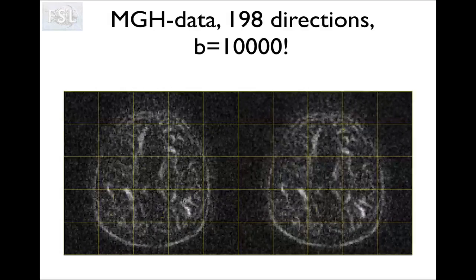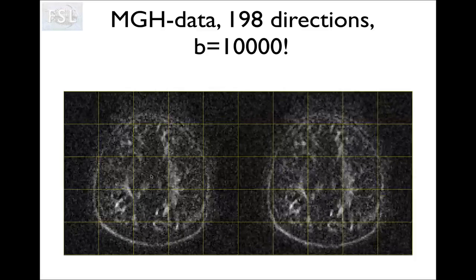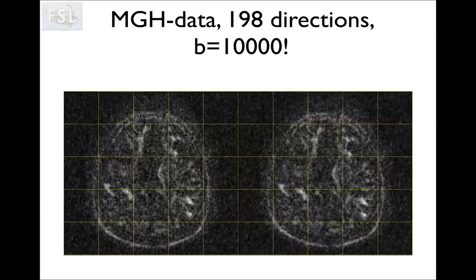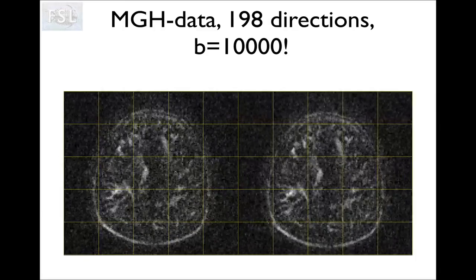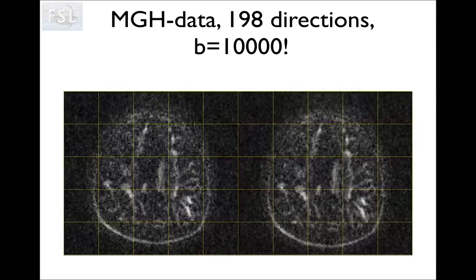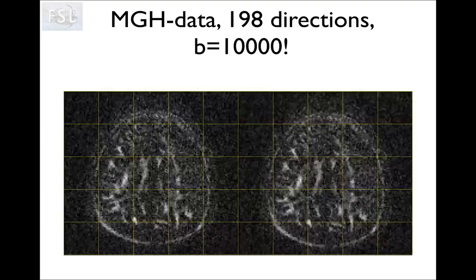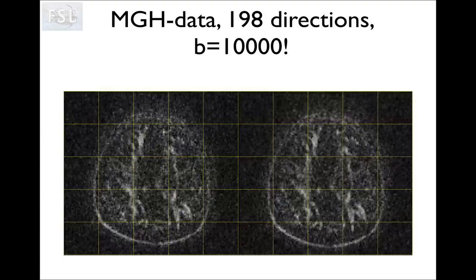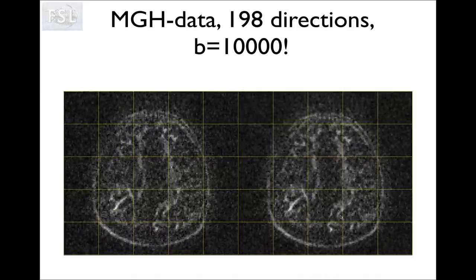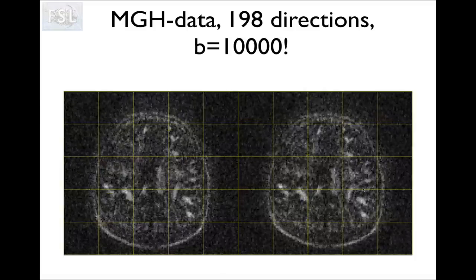And if you look at the left hand side, this is before any correction. If I were able to stop this video, which I'm not, annoyingly, you would see that the individual images are completely different. There's no way you could tell they're even from the same brain just by looking at two individual images. And yet, if you look here on the right, you can see that it's done quite a good job of correcting the distortions.